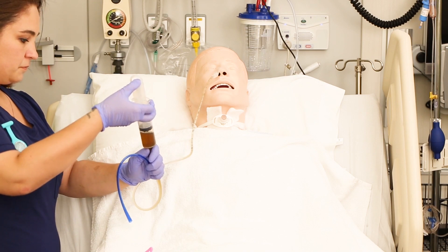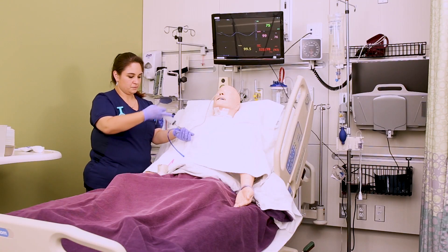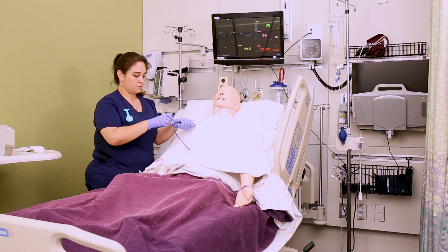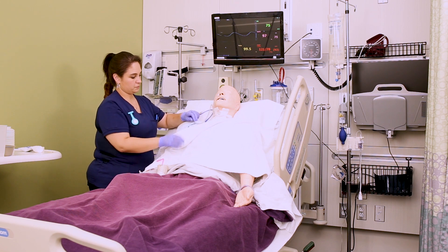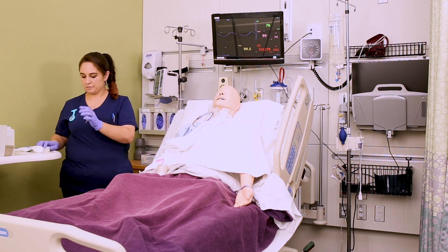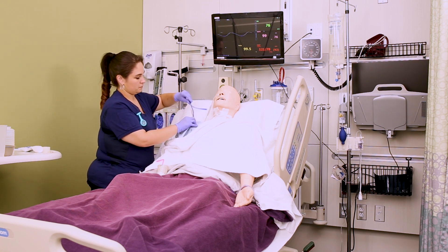If the pH is more than four, or if at any point during insertion the patient starts choking or coughing, pull that tube out — it is not in the right place. You can clamp the tube and secure it to the patient's gown, usually just with a piece of tape, and wait for an abdominal x-ray. Even if your pH is right, you cannot put anything down this tube until that x-ray confirms placement. It really is the gold standard here.